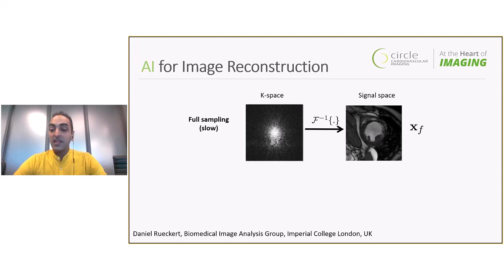Physics of MRI is completely different, however, and we will probably need multiple sessions to talk about the physics of MRI. But I want to focus on one important part right now, and that is to understand how the signal of an MRI scanner is being collected. And this signal that is being collected is actually not in the image space the way it is done for digital photography or X-ray imaging. The information is in a frequency space that in the context of MRI we call the K-space.